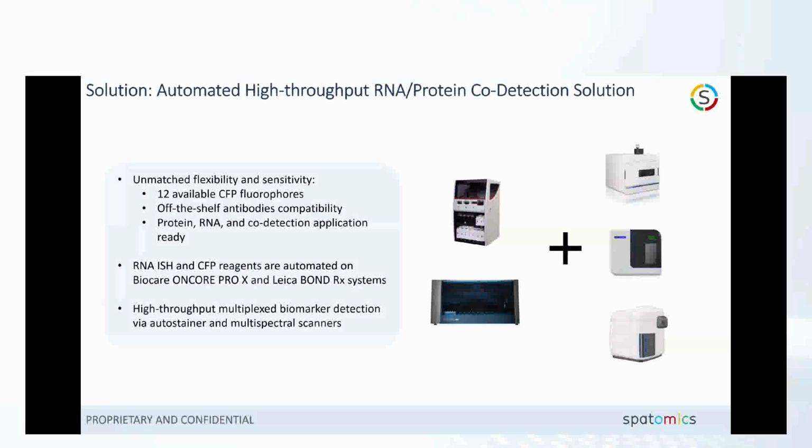A lot of people have been asking us about the umbrella effect. So we have done 2 experiments. One I mentioned during the presentation, that we've been using the same antibody, repeatedly staining the same marker, and we are getting a similar reading each cycle. The second experiment is also an interesting one. We stain 2 different isotypes of CD3, I think a CD3D and a CD3E. And then we stain CD3D and H3. CD3D and H3 are very far apart; one is a surface protein, one is a nuclear protein. And CD3D and E are supposed to be two epitopes very close together. With this experiment, we are getting a similar CD3D reading, no matter if it's co-stained with CD3E or with H3. So to us, at least at our current plexing level, we don't really see much steric hindrance affecting the results.